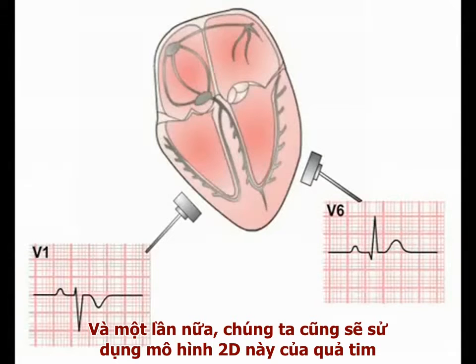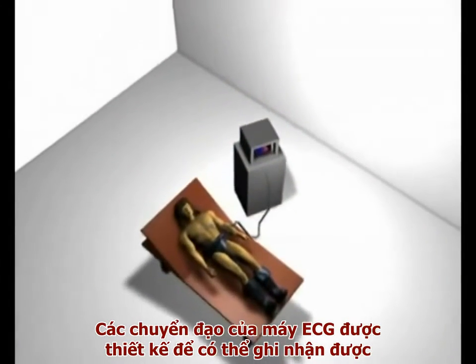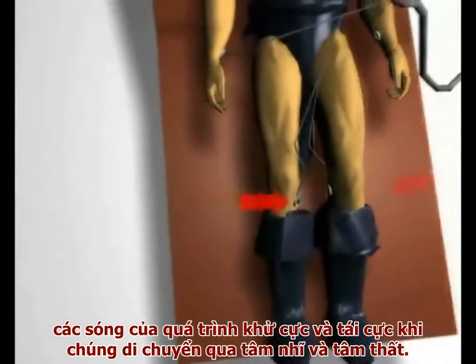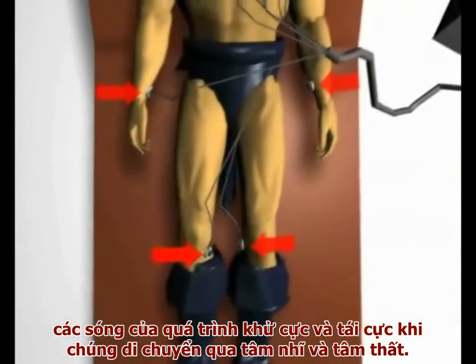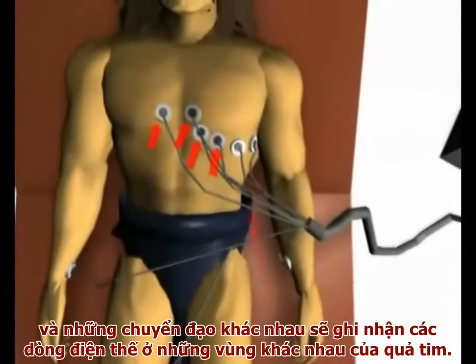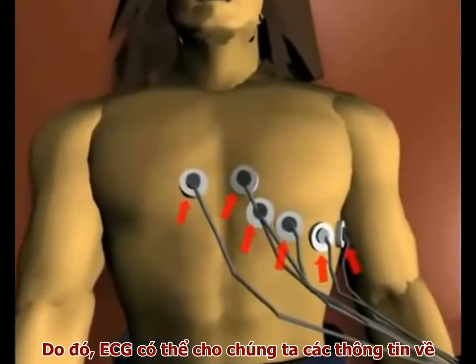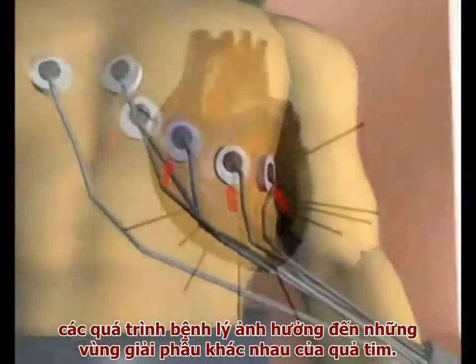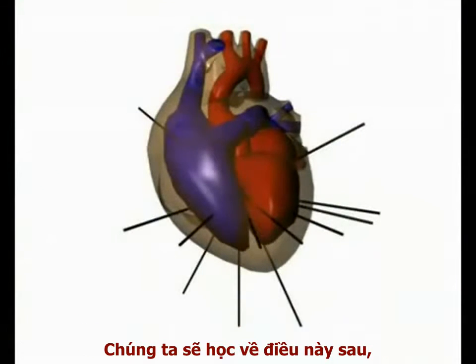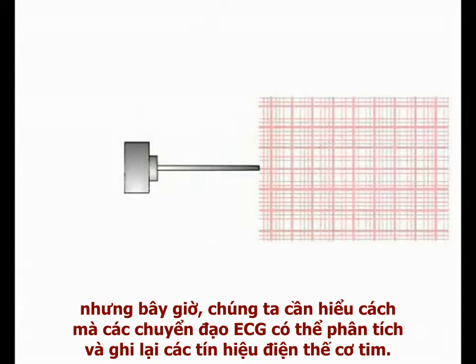We will work with the 2D schematic of the heart as explained in video 1 of this section. The leads of the ECG machine detect the movement of the cardiac depolarisation and repolarisation waves as they spread through the atria and ventricles. Leads capable of detecting electrical signal are placed on the patient's body, and the different lead positions record the flow of current through the heart from different perspectives. The ECG recording can give us information about disease processes affecting different anatomical regions of the organ, but for now we need to understand how the individual ECG leads analyse and record cardiac current.